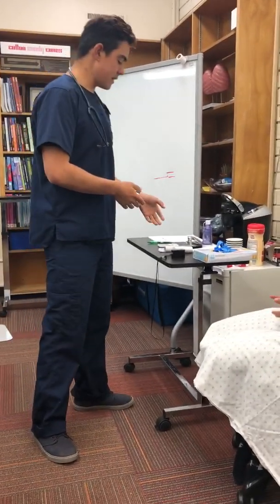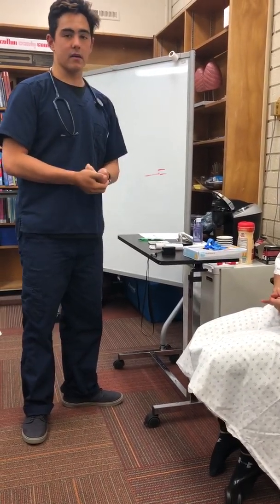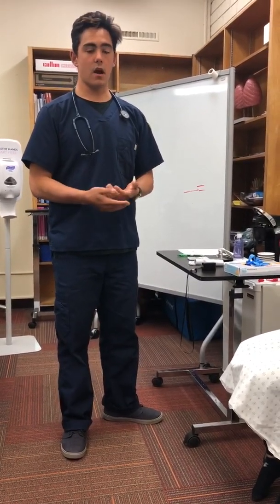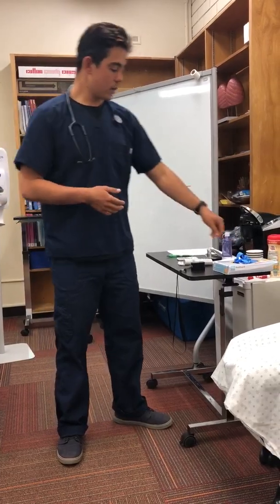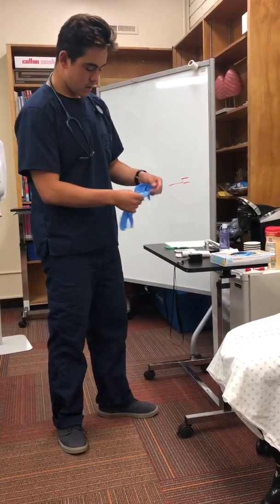So we're going to be doing it through the metered dose inhaler, and we'll walk through that in just a second. Okay. So I have now explained the procedure, some of the side effects, and I've gained consent. If there's any family members in the room, which there are not, we can go ahead and gain their consent as well, or their understanding, see if they have any questions. So after that, we're going to apply gloves, and we're going to begin taking vitals.